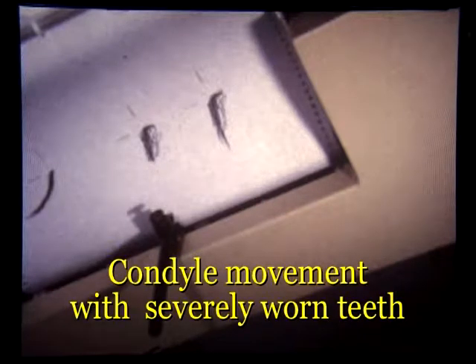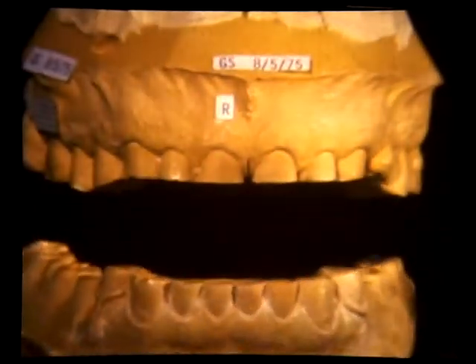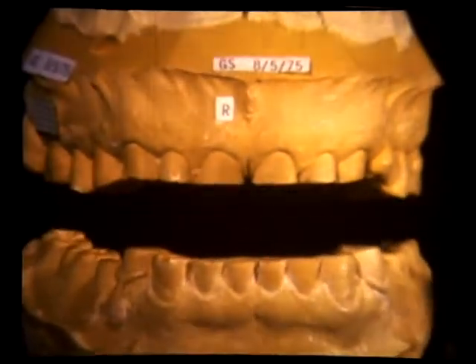The computer plotter also draws the movements of the condylar points that correspond to the same movements that we were watching at the incisor. This frontal plane view of the incisor point shows the cross-arch opening, movement toward the food side, placement of an arrow on the closing path, and no pause at the intercuspal position, which is very ill-defined in this subject.